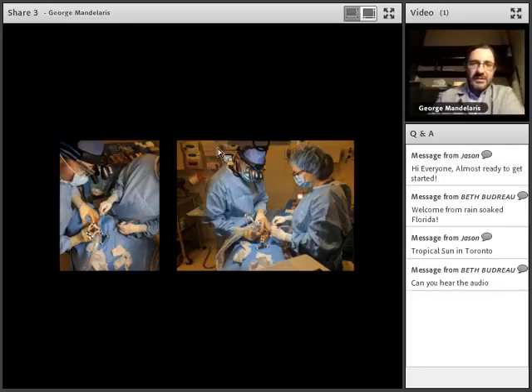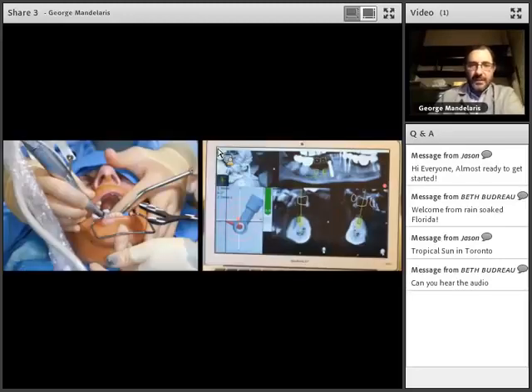It's interesting getting used to this, because here I am looking at a computer screen, really not looking at the patient. My assistant Gabby is checking the patient, making sure there's no bleeding. She's making sure that the osteotomy site is looking good. She's got her eyes on the patient and the oral cavity, but my focus is really on the computer, on all the accuracy checks and making sure that is correct.